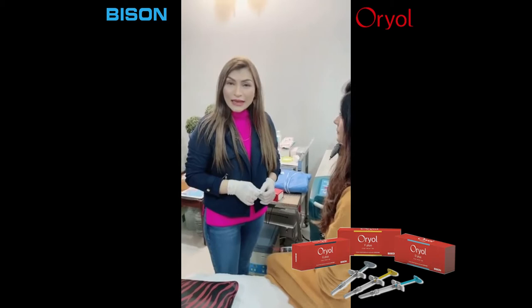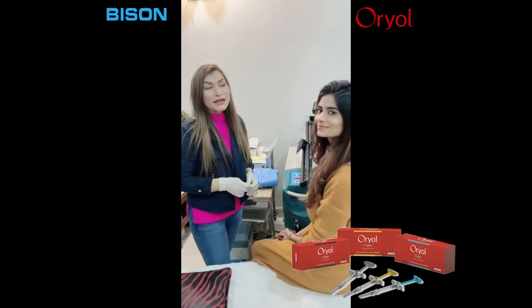Hello, I'm Dr. Laila. I'm working at ZS Thartics Clinic and today we are doing lips of my patient.